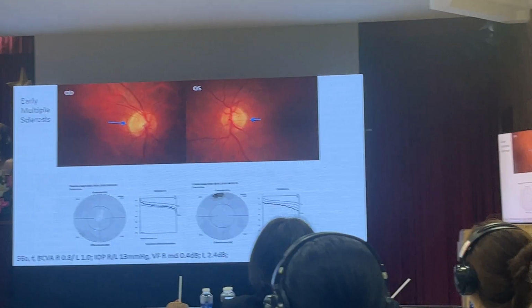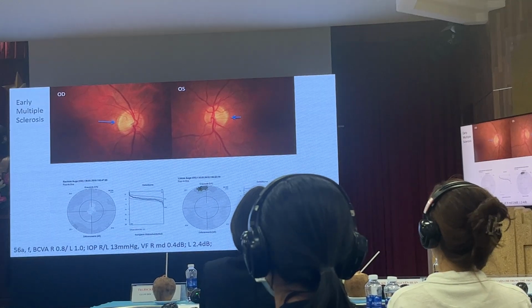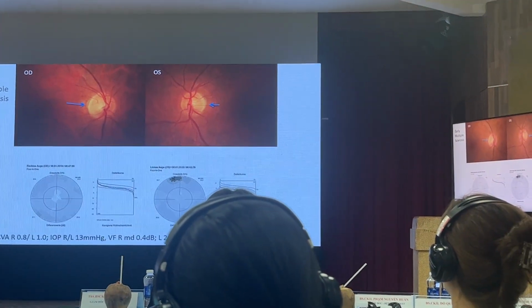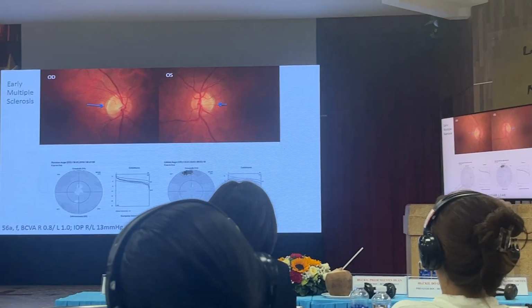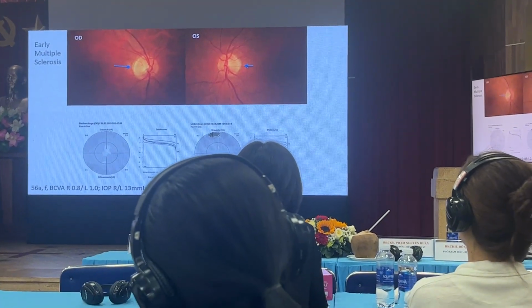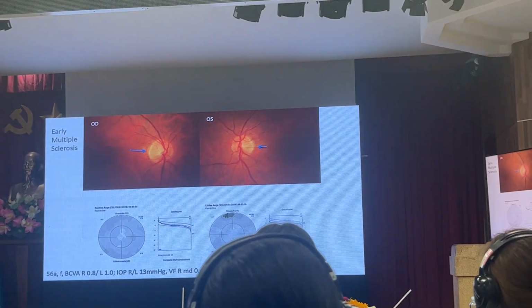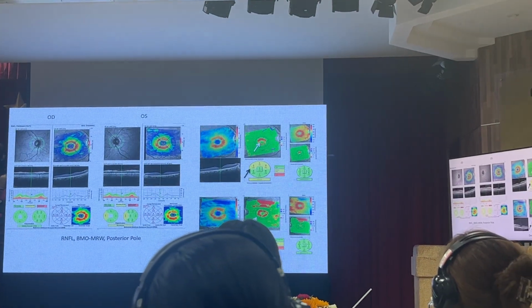This patient came to us because of subjectively decreased vision, clear media, a 56-year-old woman, and before she had no history of any inflammation and thought she was healthy. When we look at the disc, we saw slight pallor on the temporal side. The visual field was not too bad in this patient, and this patient can easily be sent away and told, okay, dry eyes, you get lubricating eye drops, go to another colleague. You don't have anything. But sometimes it's worth looking closer into the patient.